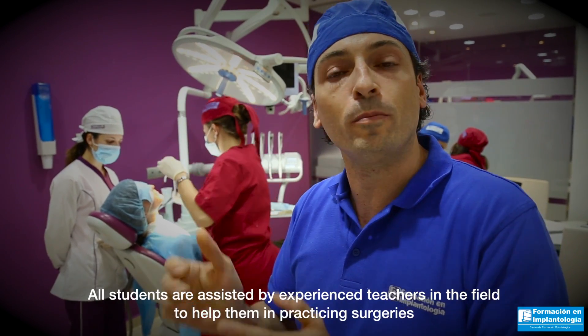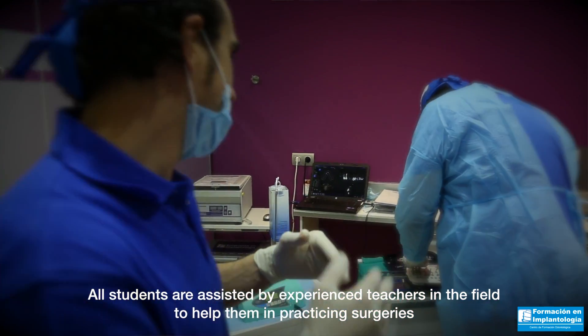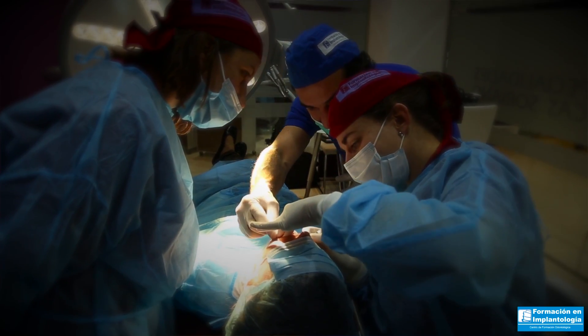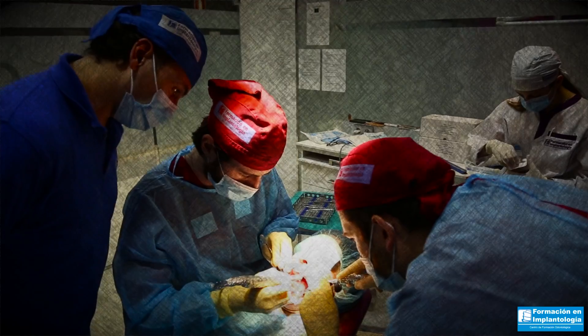All the students are assisted by expert teachers in the field to help them practice surgeries. The idea is to improve and perfect the technique they already have.